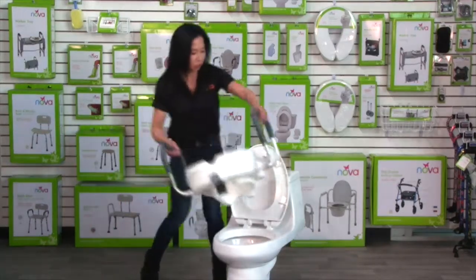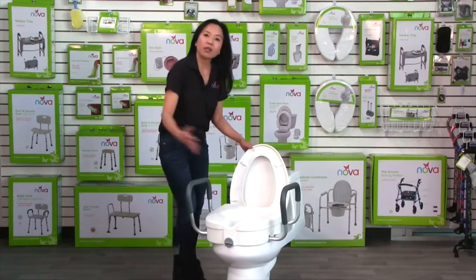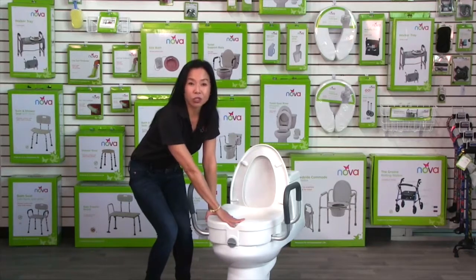You simply put the toilet seat on and in most cases it will fit with the lid on. Now if you find that your raised toilet seat is pushing up against the lid, you just simply have to remove the lid. In most cases the lid stays on, and then you want to lock it onto your toilet.